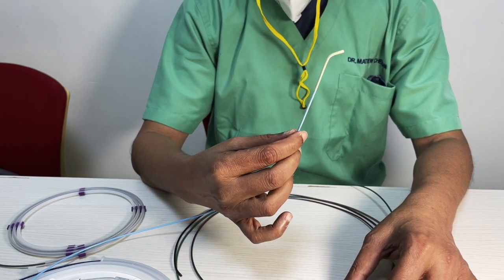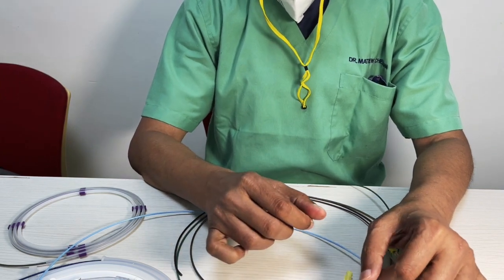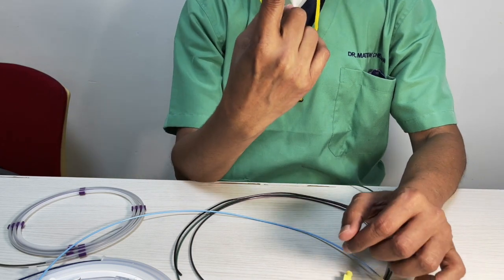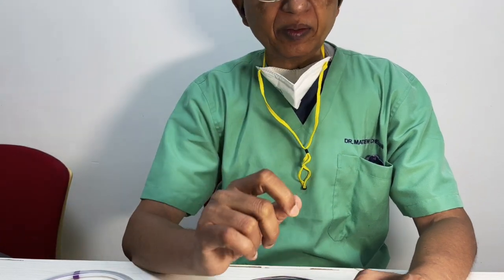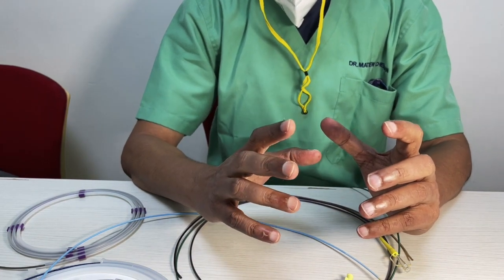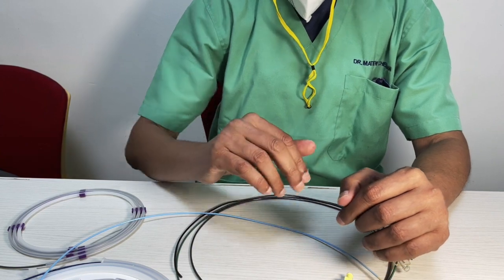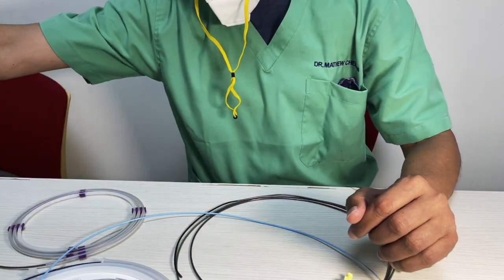Now imagine the same microcatheter is put in a vessel which is, say, as thick as my thumb or as thick as my finger. What's going to happen in this situation is the microcatheter will start taking an S-like bend. You understand what I'm saying, right? So when it takes an S-like bend, the pressure transmission will not be in line, but it'll go in the direction of a loop.